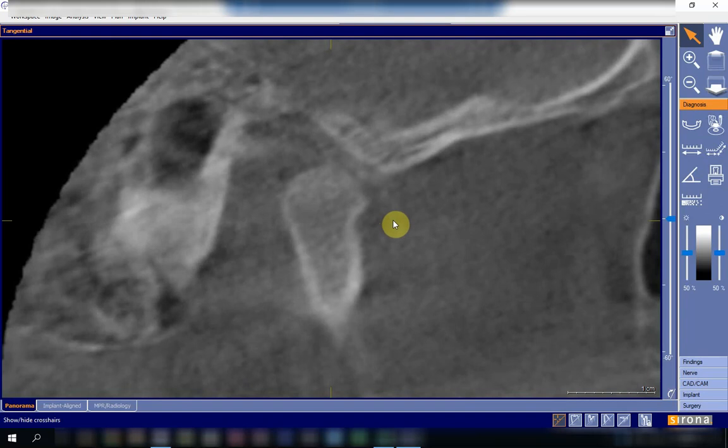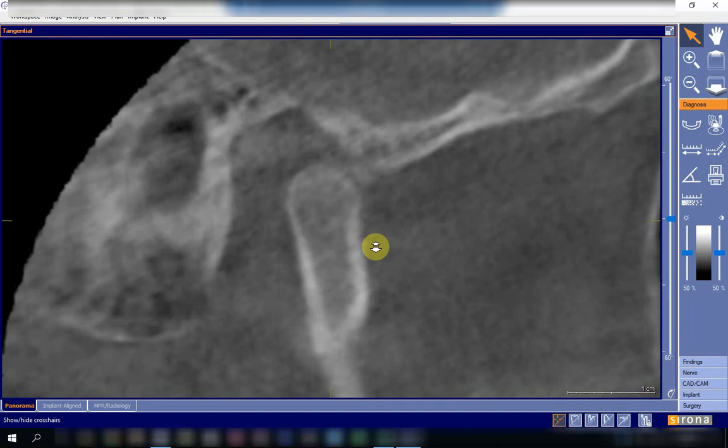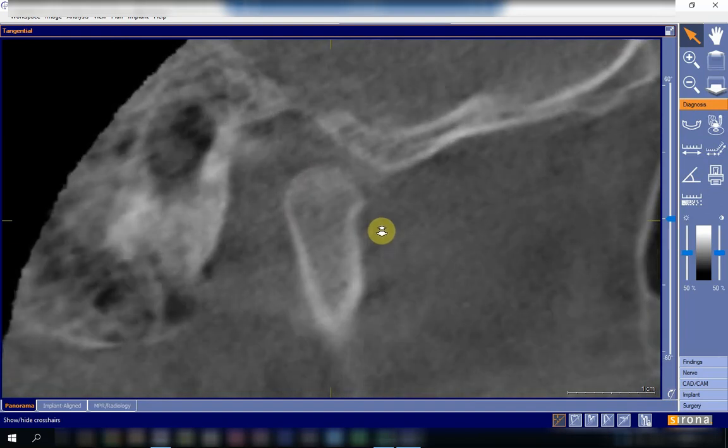That is bony projections from the condylar head. So what we look for is the surface integrity. It should be smooth all around in all the slices and all the image thicknesses, because when we see an image here, actually we are not seeing the whole condyle. What we are seeing is only part of it.